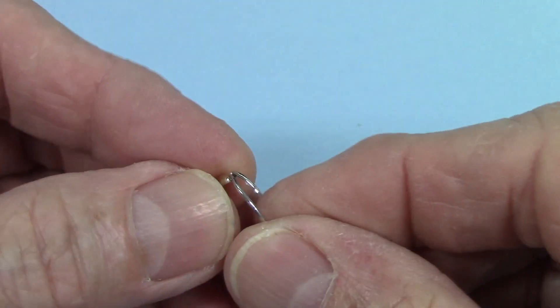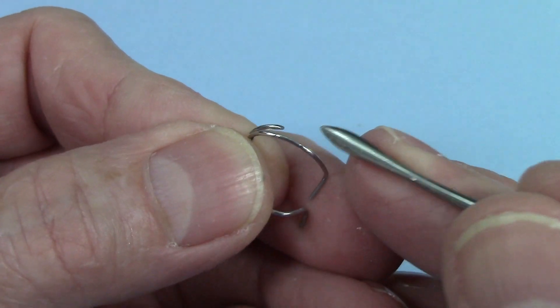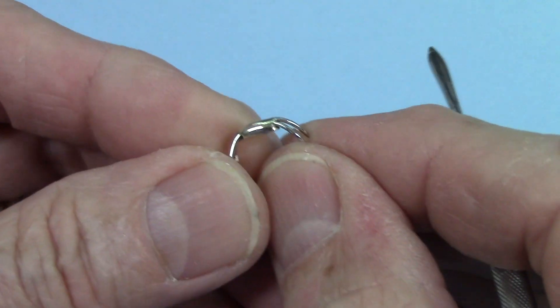One thing I do on this clasp is when I bend this crescent wire, I will taper the end of it. I just take a rubber wheel and go over the end of it and smooth it so that it's not just cut off and jagged on the end.